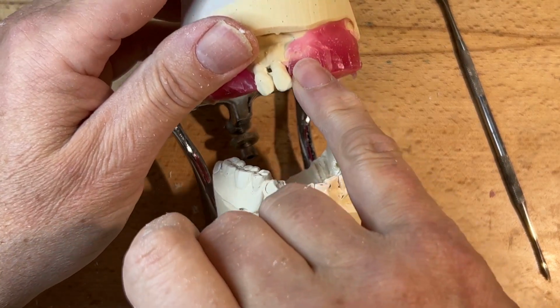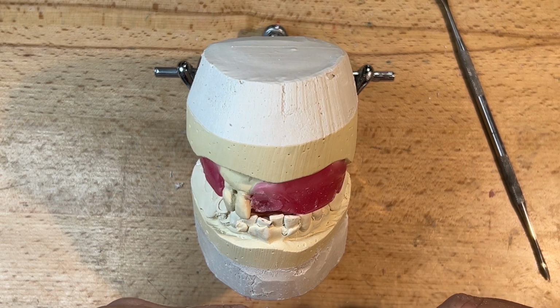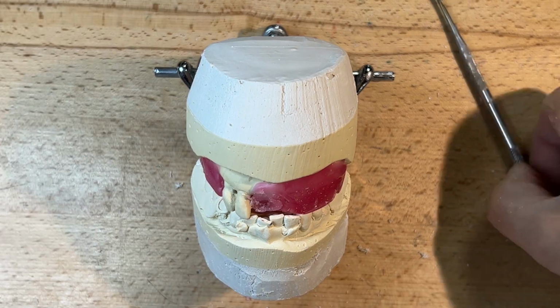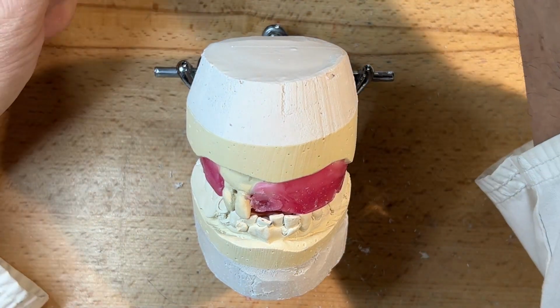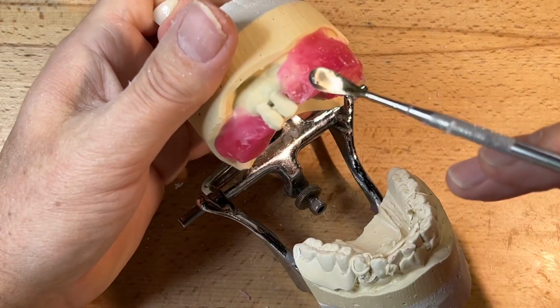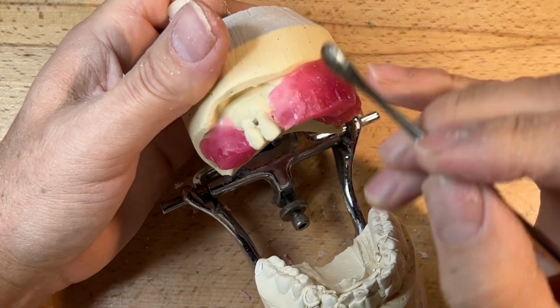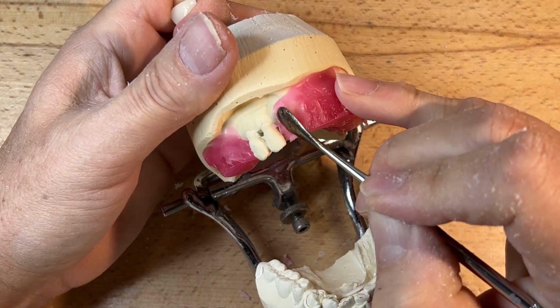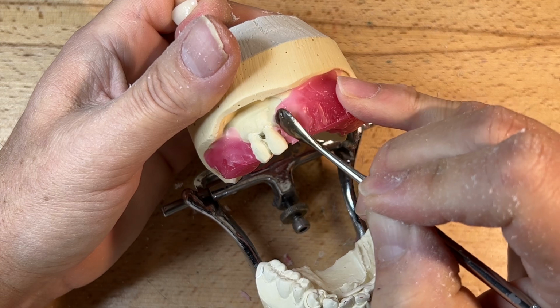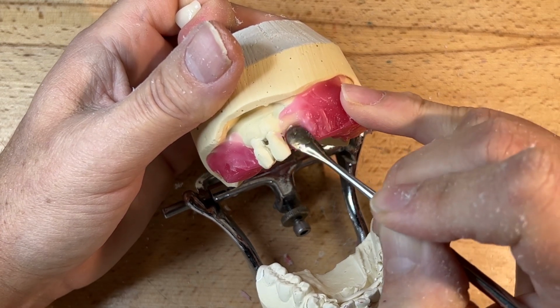You can see here on the ridge where it's hitting my denture tooth, and I'm going to reduce the ridge lap slightly a little bit more and try to get this denture tooth emerging out of the alveolar bone here. That would make it look a little bit more natural.